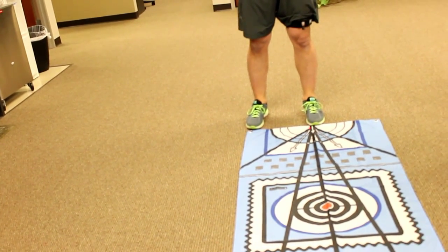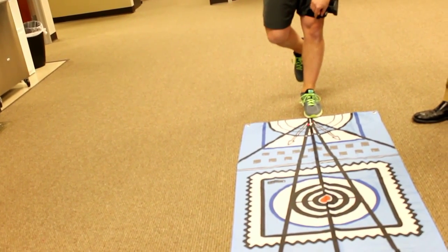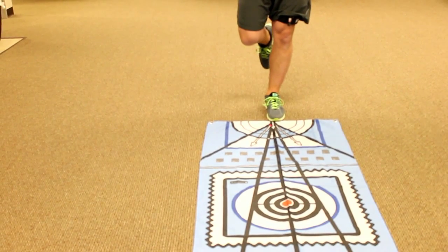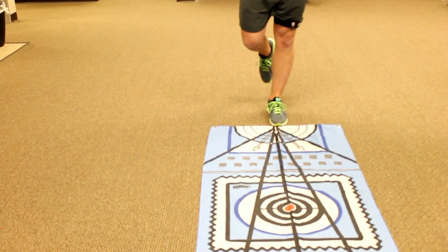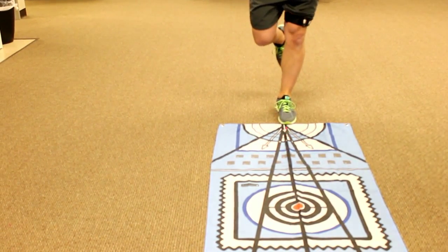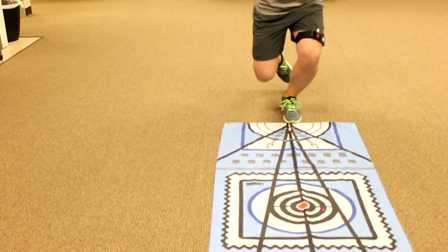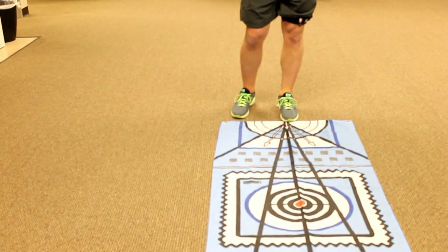Now I want you to stand on the left side and I'm going to re-center the laser. Just stand there comfortably. I'm going to put the laser right over the center arrow. Now I want you to look out in front again, ahead of you, not down at the laser, and do five single leg squats for me. Once again looking at quality of motion from the sagittal plane as well as the frontal plane of motion.